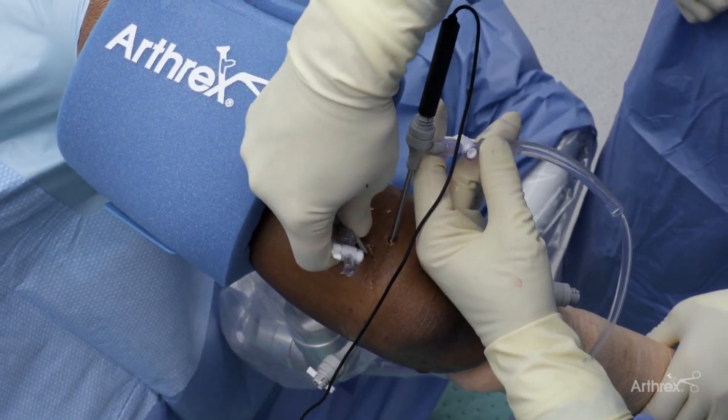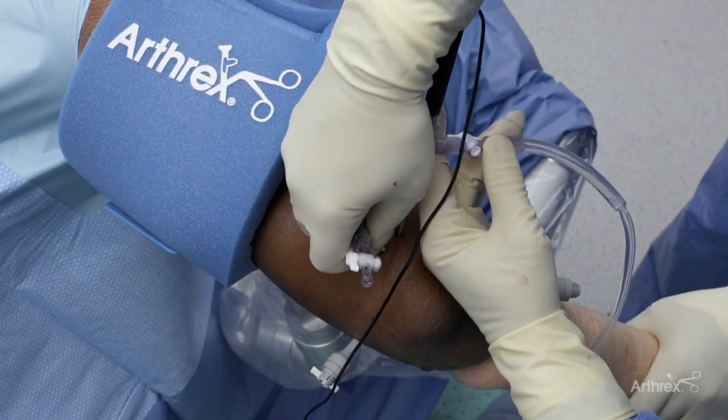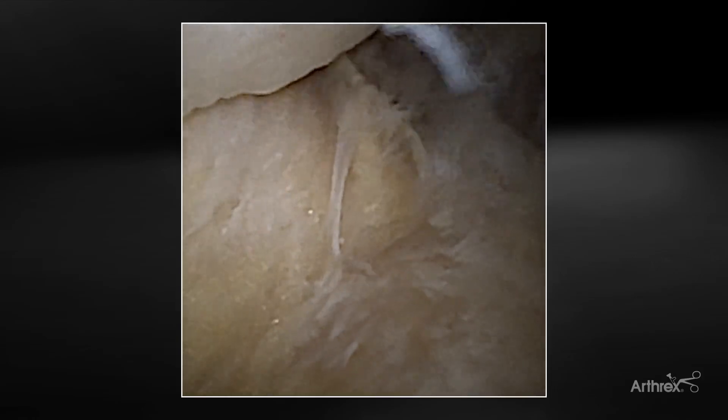These are extra portals — you want to limit your portals when you do arthroscopy and be cognizant of fluid extravasation. Now you can see the olecranon tip. We're looking way over into the medial gutter and you can see your ligament. You can assess by extending the elbow whether you're coming all the way down and not hitting. Sometimes there are osteophytes or bone spurs, especially in pitchers, that you have to trim out. This is an excellent view to fully visualize what can be taken care of in the posterior fossa, where very often this is where the pathology lies.